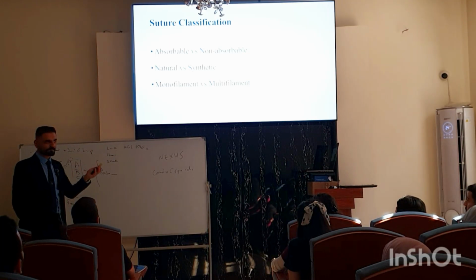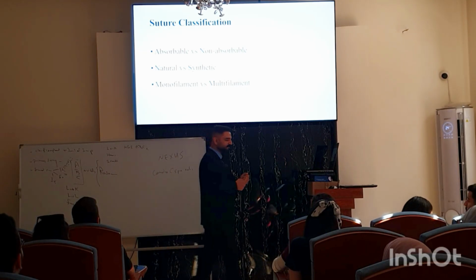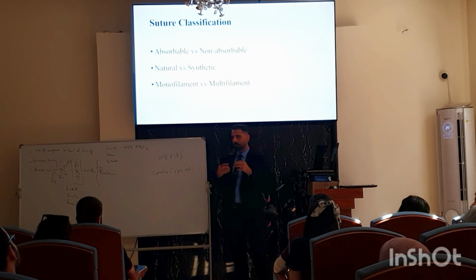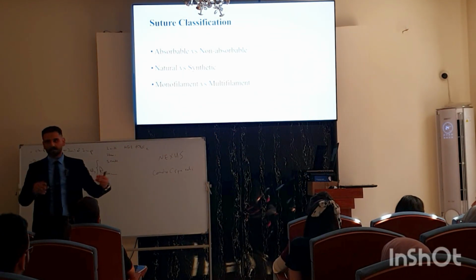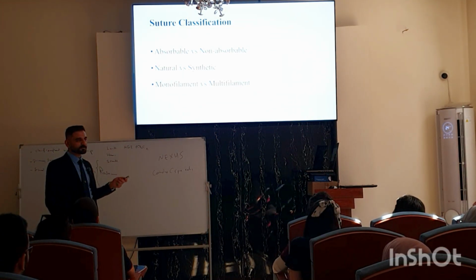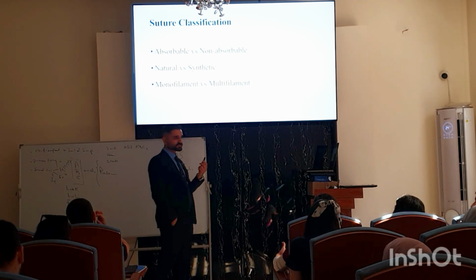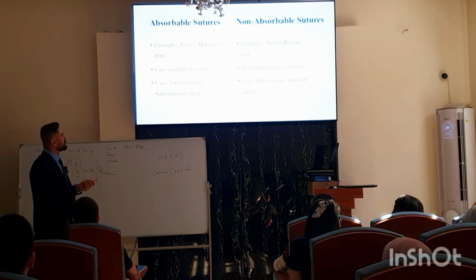The monofilament versus the multifilament. Even in daily life, we have this rope which is made of polyfilament, made by connecting multiple threads to form a larger structure, and the monofilament is something like a pipe, a structure of a single thread. It's not multiple threads together.